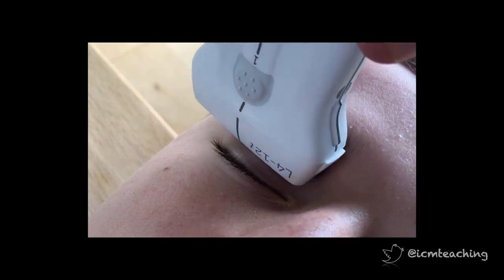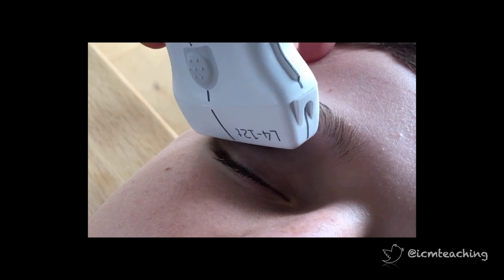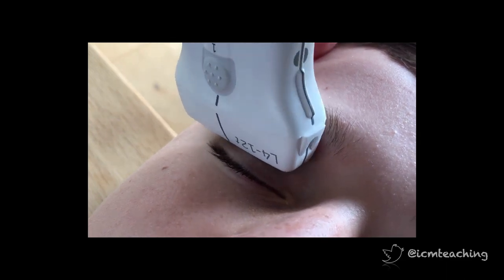So this makes sense. This clip shows you how I'm moving the probe to get these images. I'm tilting from a lateral to medial position and then back again.